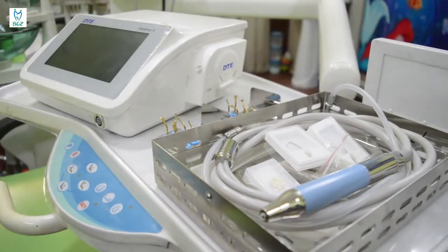Hello everyone, today I am going to discuss about piezo surgery unit and its application in modern industry. At the end of the procedure, we are using piezo surgery unit for doing impaction — third molar impactions — that comes up with postoperative swelling.